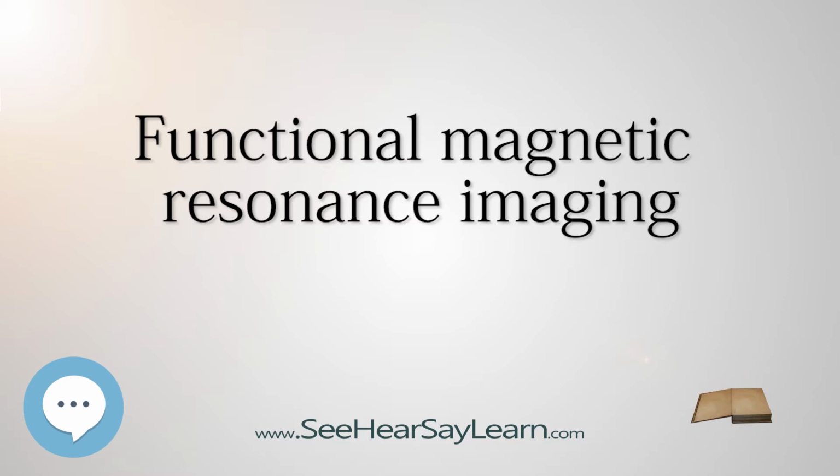More recent characterization of the BOLD signal has used optogenetic techniques in rodents to precisely control neuronal firing while simultaneously monitoring the BOLD response using high field magnets, a technique sometimes referred to as opto-fMRI. These techniques suggest that neuronal firing is well correlated with the measured BOLD signal, including approximately linear summation of the BOLD signal over closely spaced bursts of neuronal firing. Linear summation is an assumption of commonly used event-related fMRI designs.